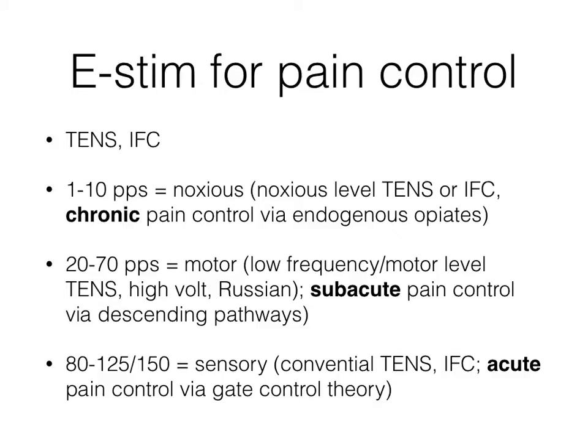Now, regardless of whether you use TENS or IFC, the treatment is basically delivered using the same frequencies, and the pain control is achieved through the same sort of three pathways. And this depends on whether the patient is in more chronic pain, subacute, or acute pain. So if the patient is in more chronic pain, we want to deliver a noxious level TENS or IFC.